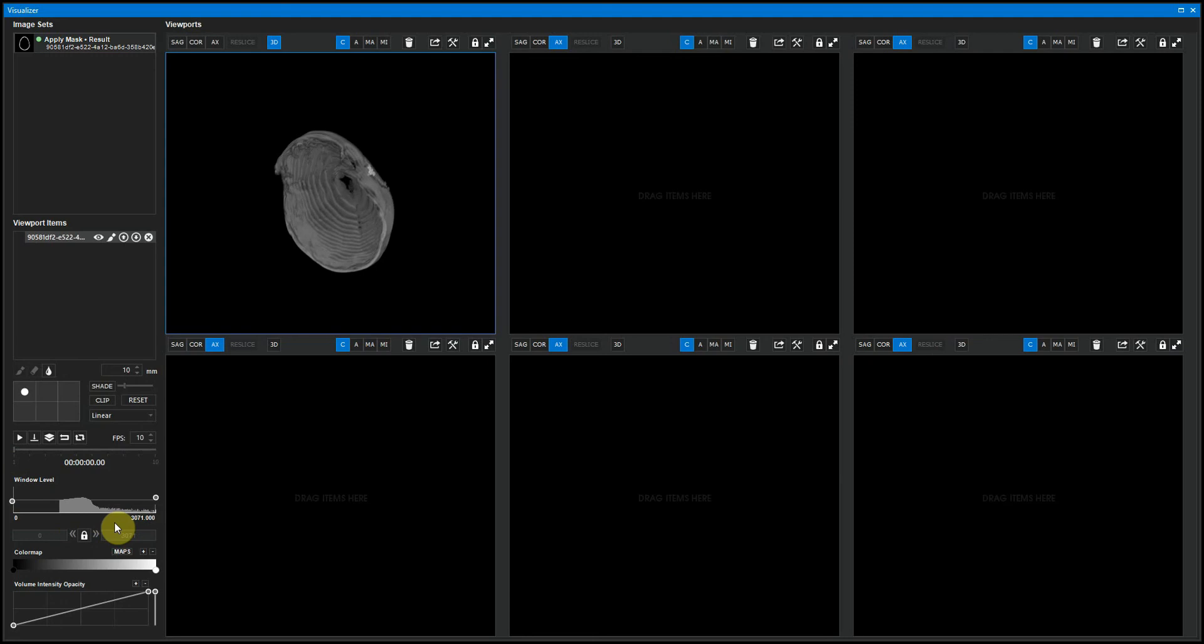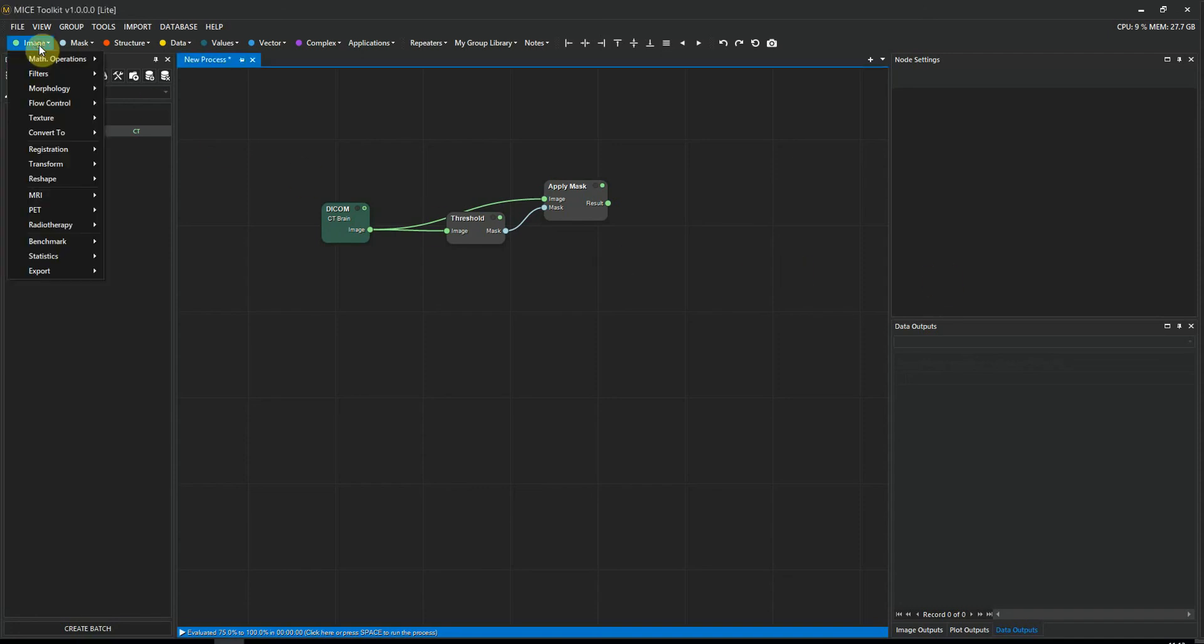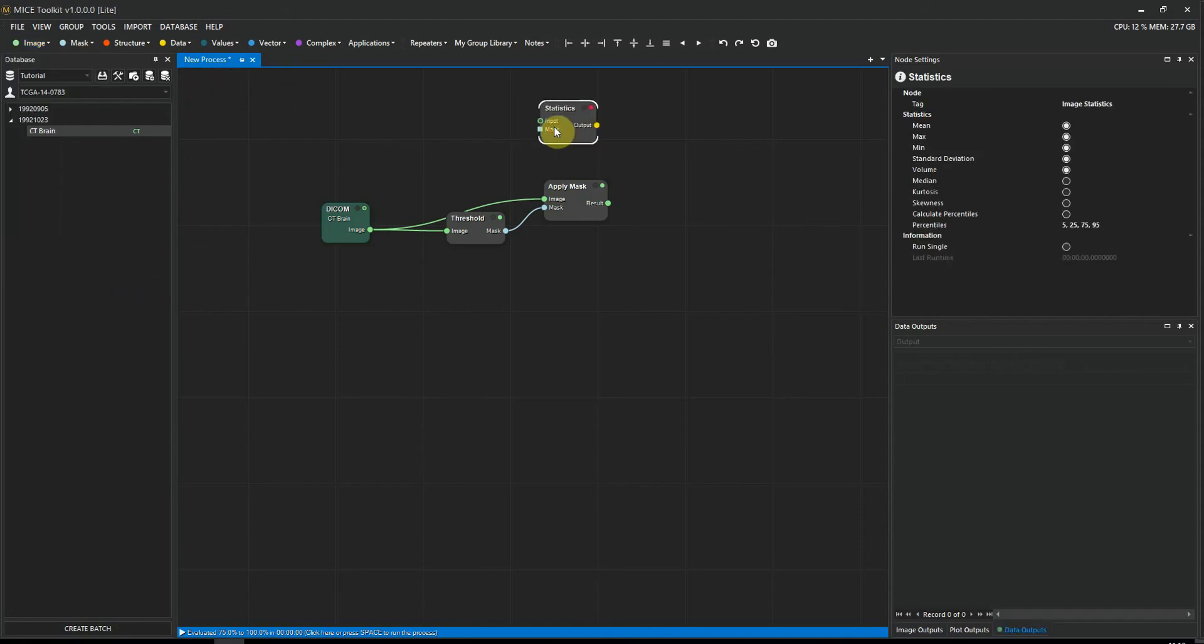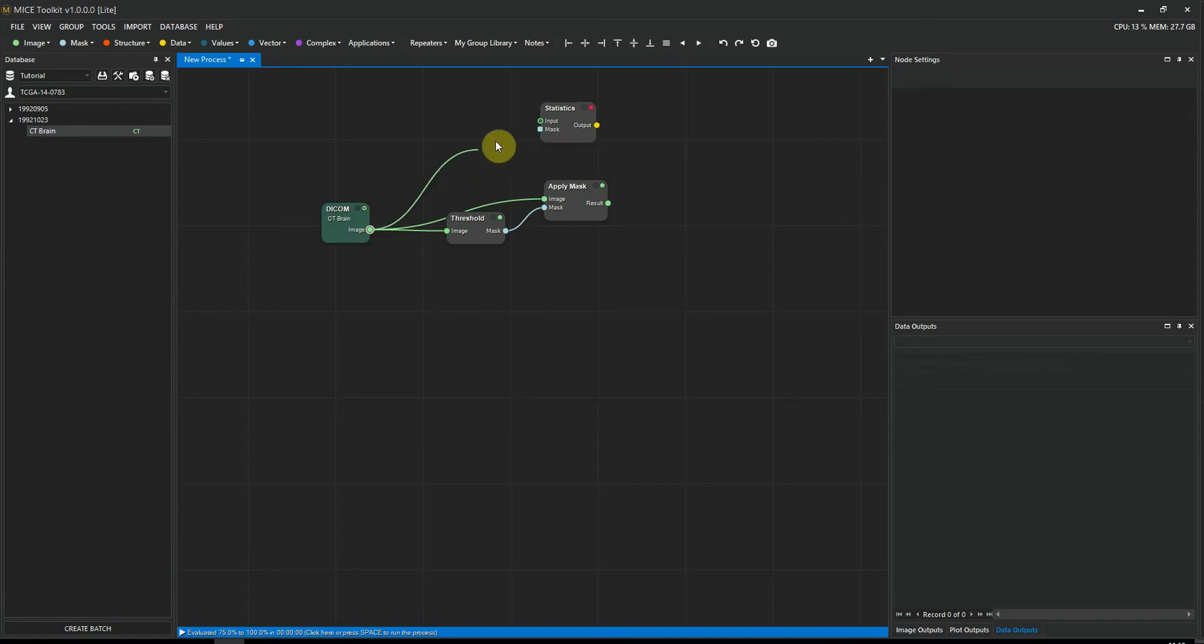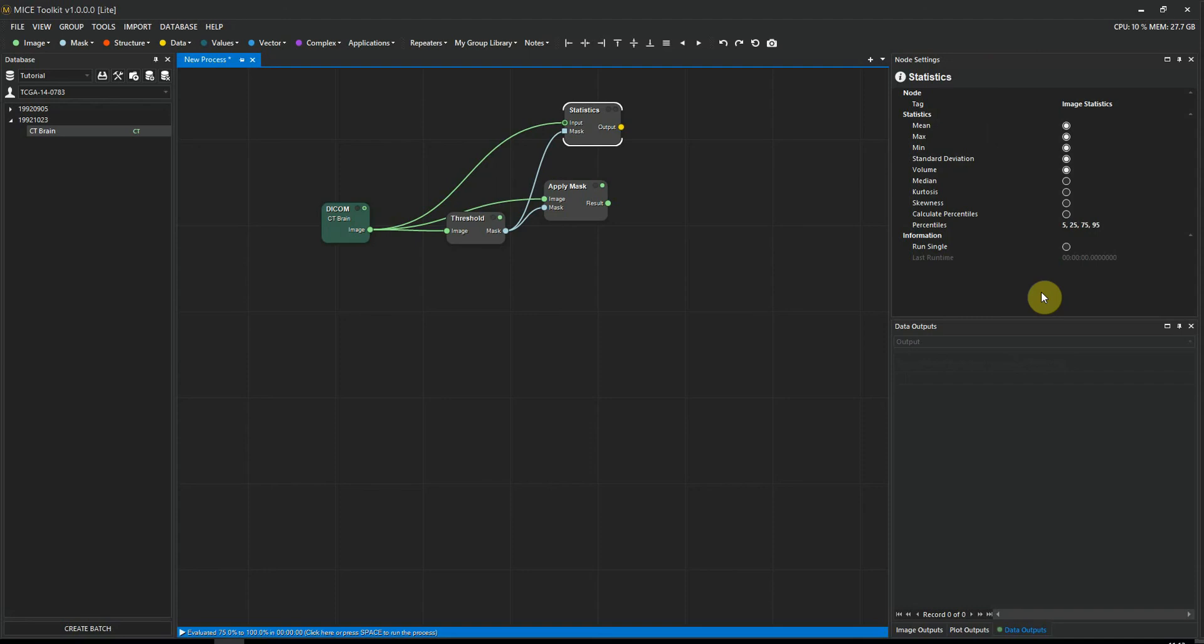Okay, now let's go back to the process window. So let's say we want to calculate some statistical properties from the image within the mask. We can do that by using a node called the statistics node. We find it in the image statistics statistics. The statistic node takes two inputs, the image and a mask. And the mask input is optional. If we highlight the statistics node, we can see in the node settings that we can select what type of statistics we want to calculate within the mask.